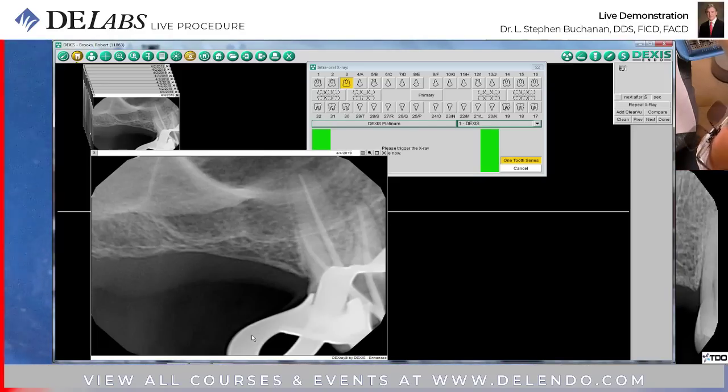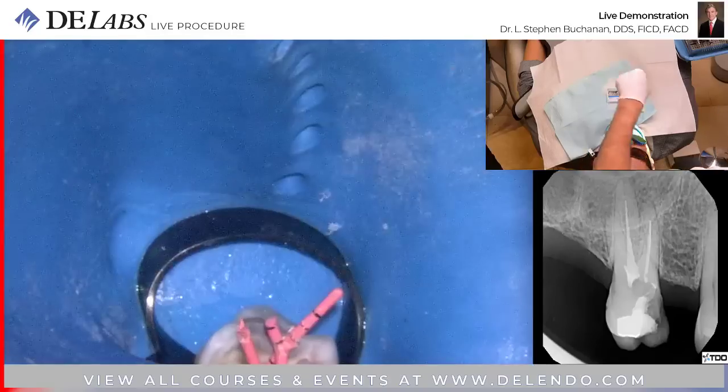Do you always check your cone fit? Always. I take more working films on cone fit than anything else. It's my last chance to have it just dead on, right? And none of us became dentists because we like it just, that's close enough. That doesn't really work.